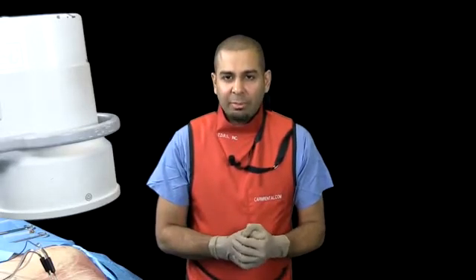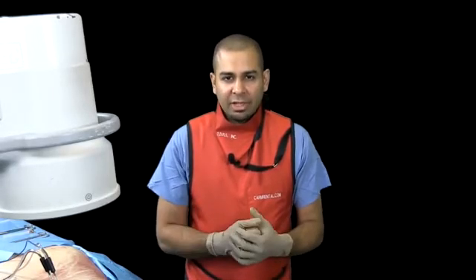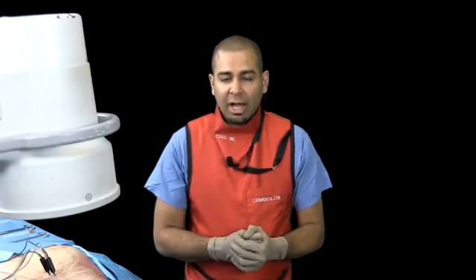What you've seen today is thoracic medial branch radiofrequency ablation performed with the Kimberly-Clark Thoracool device that simplifies the procedure while giving you an increased safety margin with a bony backstop and a distal projection of the lesion that captures the medial branch while being placed in a safe and effective and reliable manner.